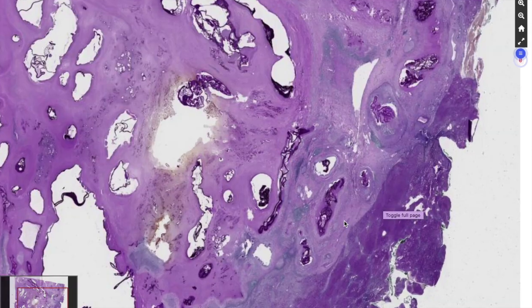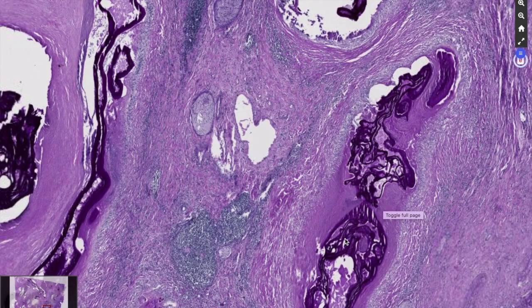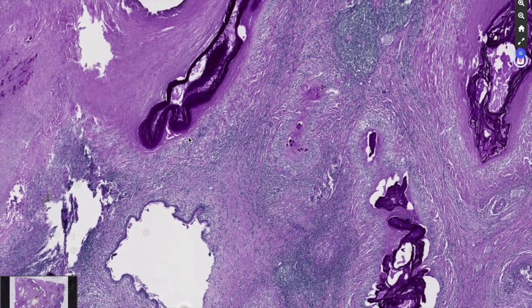You can see at low magnification that all these membranous structures are staining positive. Here, strongly positive, and again the granulomatous macrophagic reaction around these structures. So this particular appearance is suggestive of the diagnosis of Echinococcus multilocularis. You know, it's a kind of hydatid disease. Hydatid disease may be caused by the larval forms of the Echinococcus tapeworms.